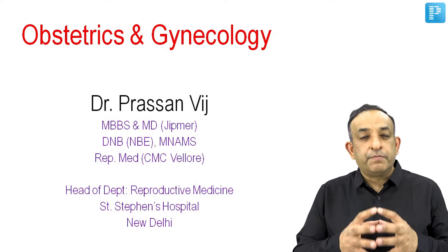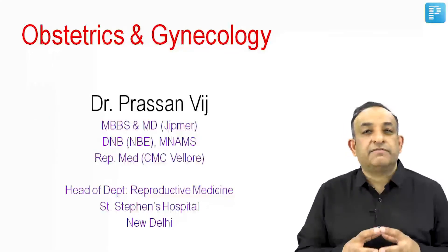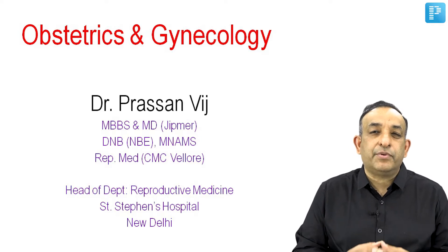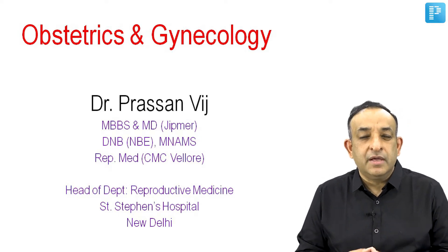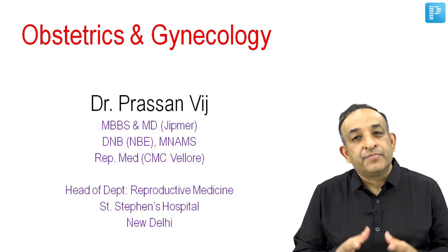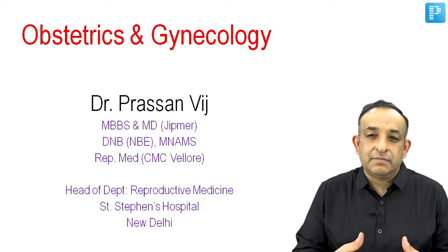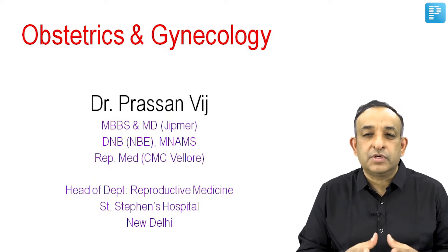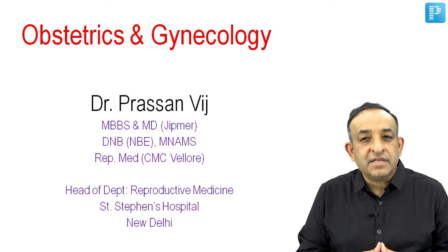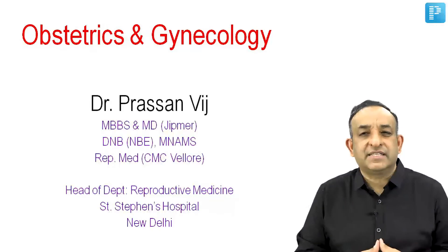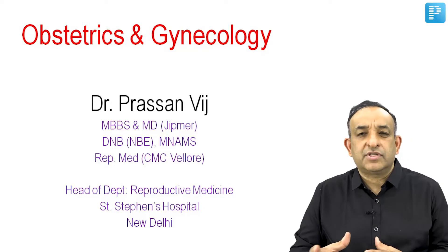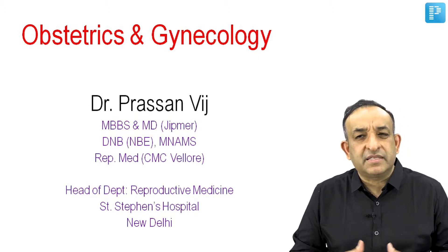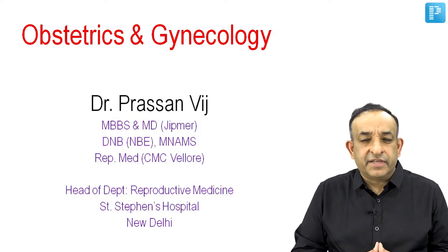The best way to assess the fallopian tubes and the pelvic anatomy in an infertile woman is to do a laparohysteroscopy, which is what we are going to see in this video. This was shot in my OT some 15 days back when I was operating on a woman who was infertile for around 7 to 8 years. She had all the basic tests — the hysterosalpingography and ovulation induction — but she was not conceiving.